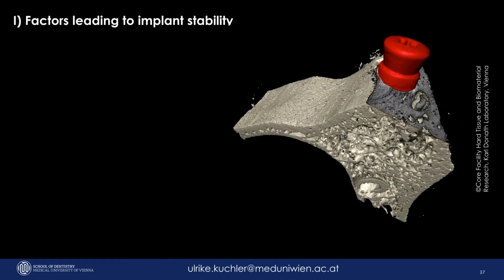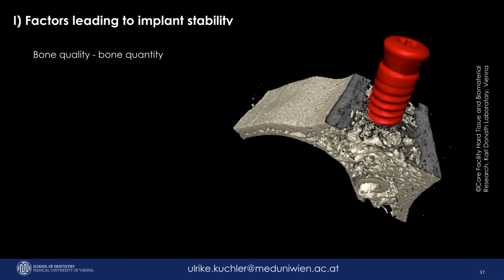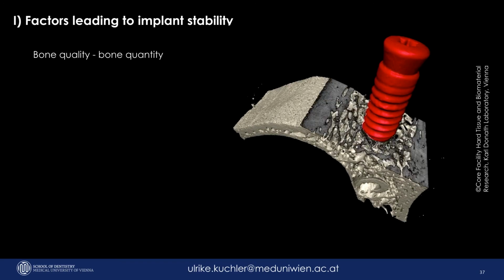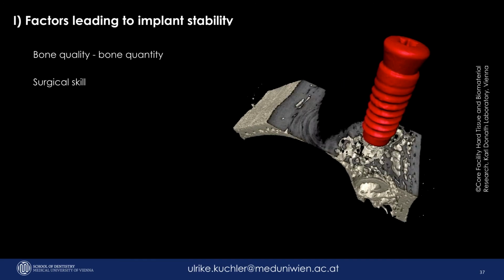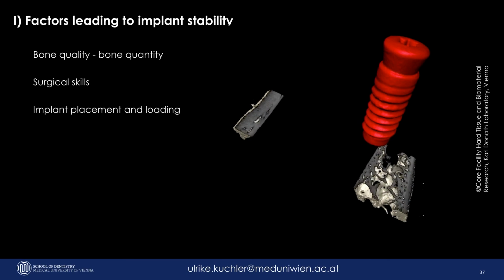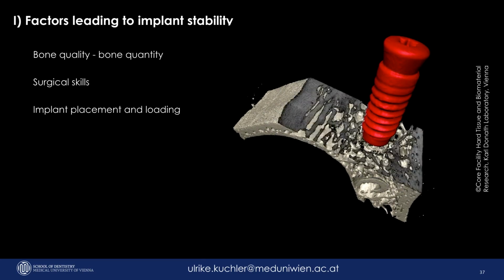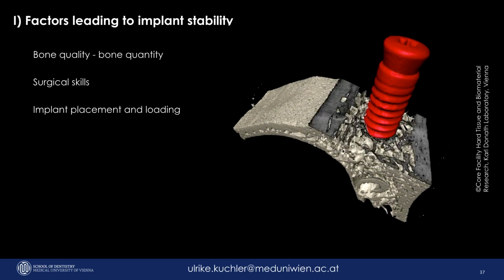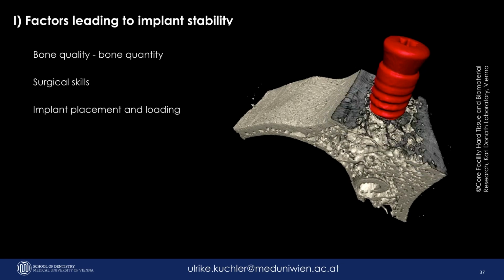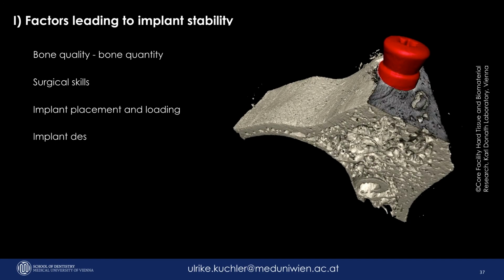So finally, I come to the conclusion that bone quality and quantity have an impact on implant stability. The same is true of surgical skills. The more we advance, the higher the implant stability gets. We have a very useful tool, not in implant placement, but in implant loading. We can really screen the time of implant loading with consequent implant stability measurements.